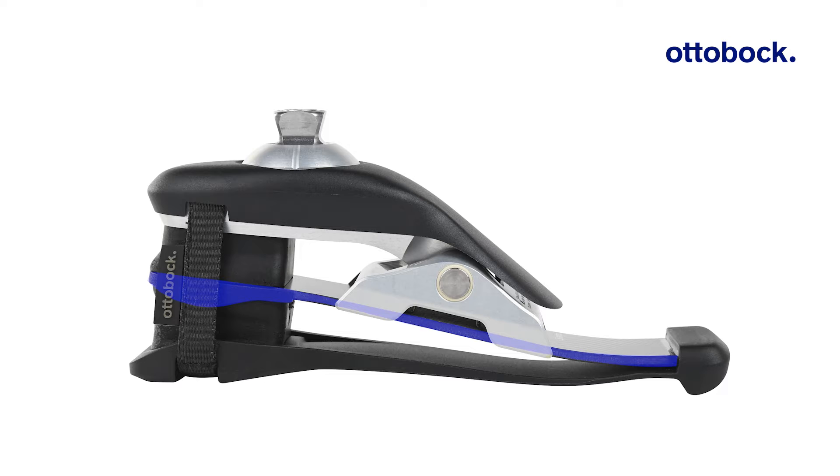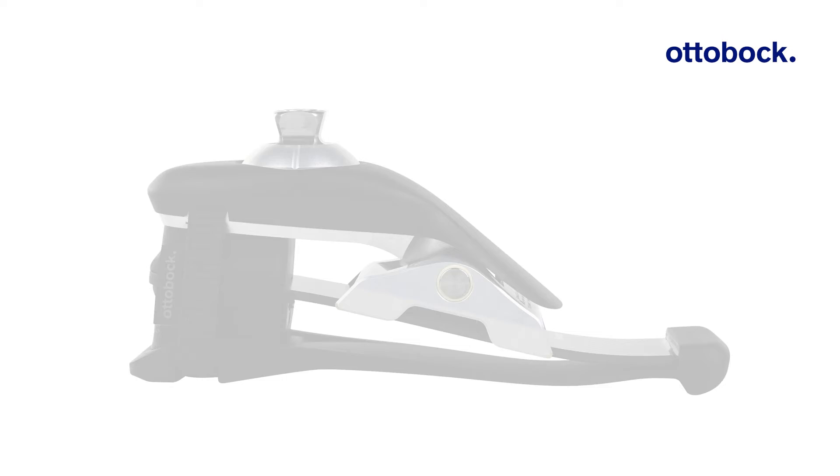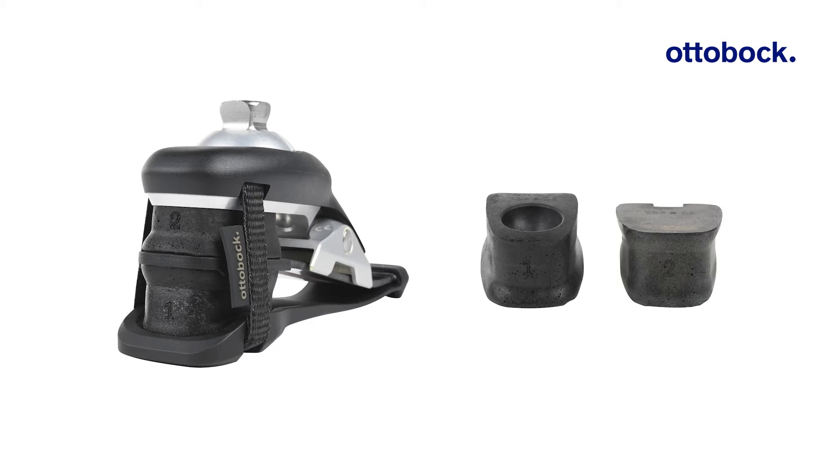Evanto's carbon spring and heel wedges are selected according to each user's data, which are based on extensive user testing. In most cases, the pre-configuration will match very well for the user.